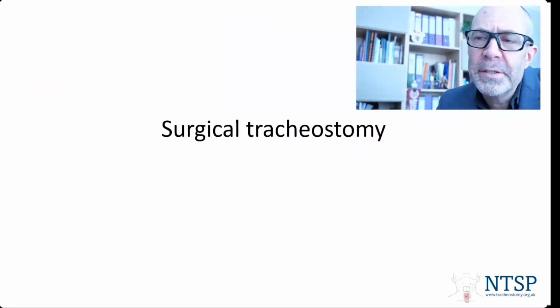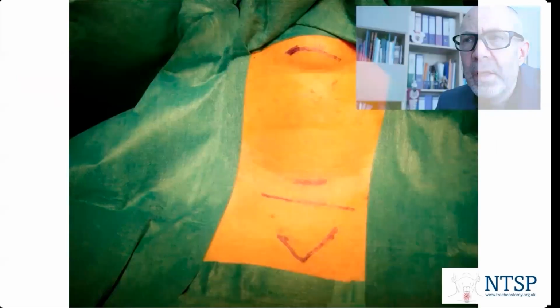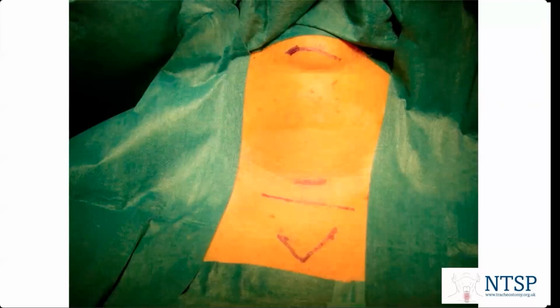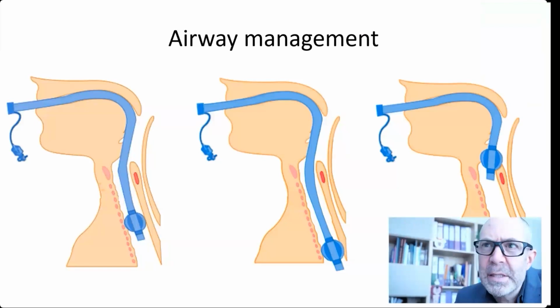Let's quickly review some indications and the practice for surgical tracheostomy then. It nearly always occurs in an operating theatre, but not always. I think airway management with any tracheostomy is really important, and close communication with your anaesthesiology colleagues is clearly critical.